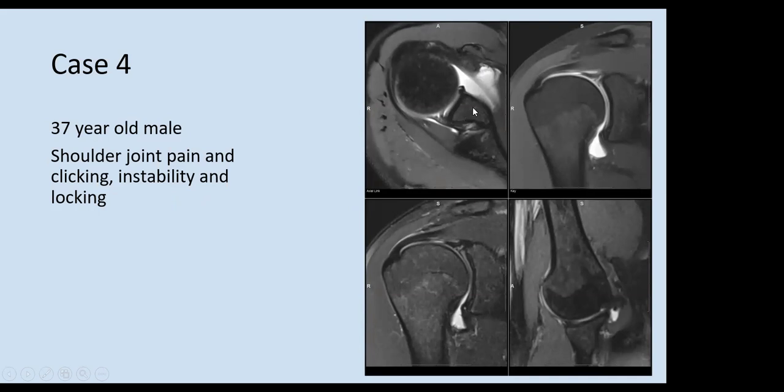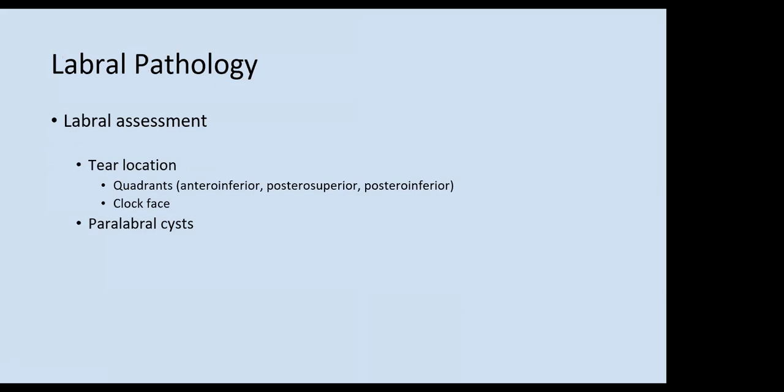So remember this, whether the shoulder is left or right, the clock face is the same. For a left shoulder, you still call this 3 o'clock. For a right shoulder, you still call this 3 o'clock. And same thing, this is 9 o'clock for a left or a right shoulder. And 12 o'clock is here and 6 o'clock is here. So always use that system. This is how we do it. And in most of the places that I worked in and trained in, we use that system.